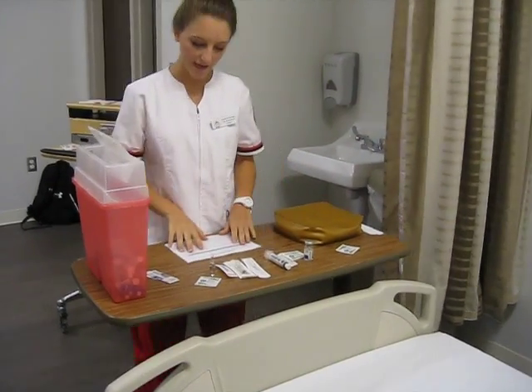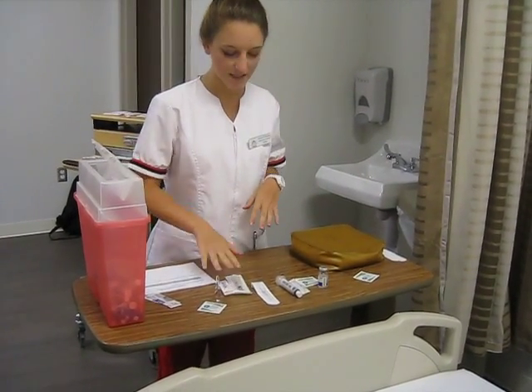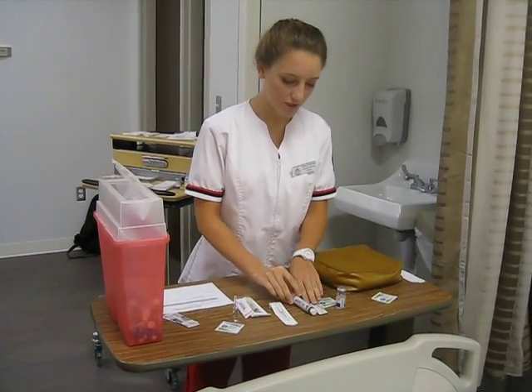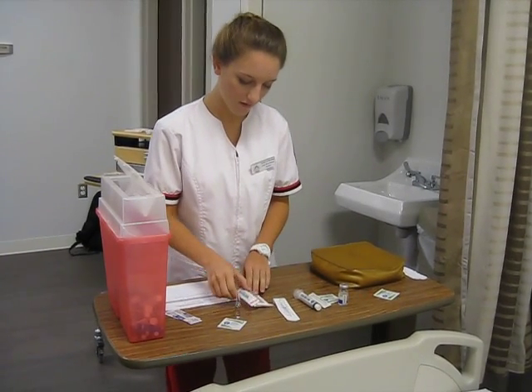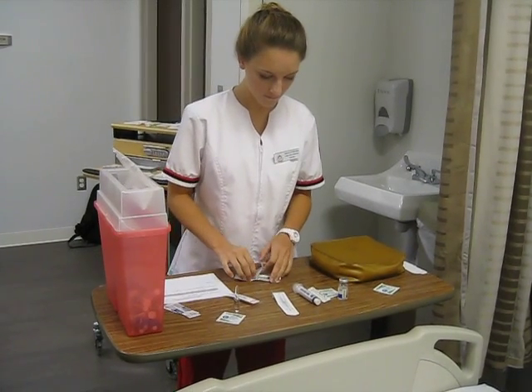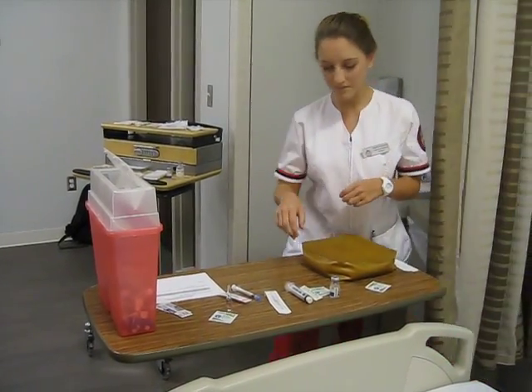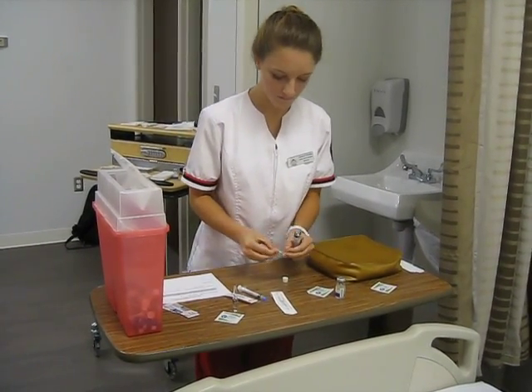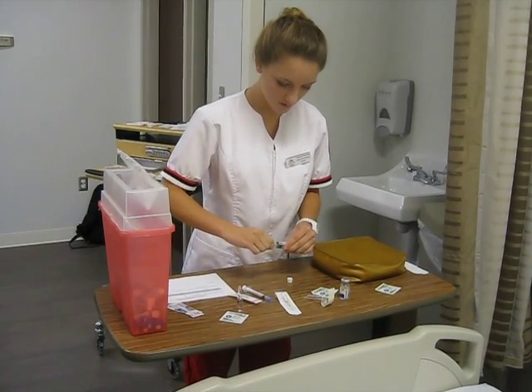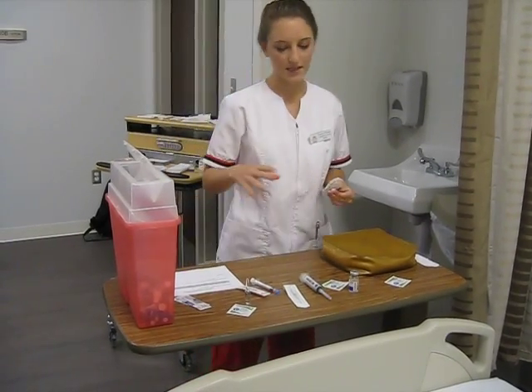So I need to first prepare my needles. This will be for my subcutaneous, and subcutaneous is going to be with the 25 gauge. And my intramuscular, which will be with a 23 gauge. This is my 23 gauge for my intramuscular. I will set up my subcutaneous closer to time because I don't want my filter straw to be exposed to air for too long since it is supposed to be sterile.